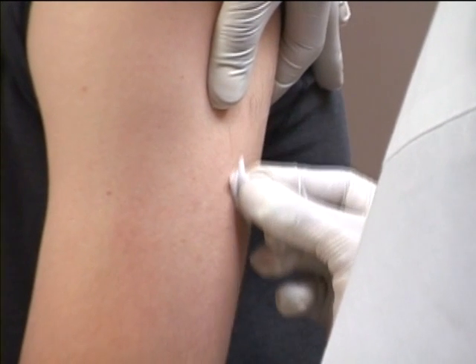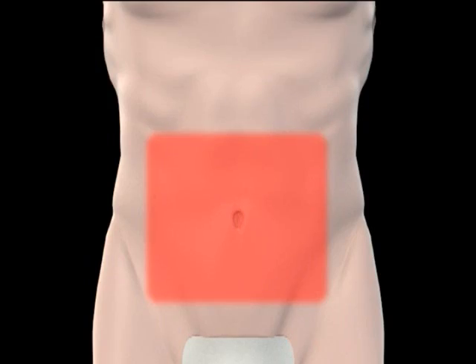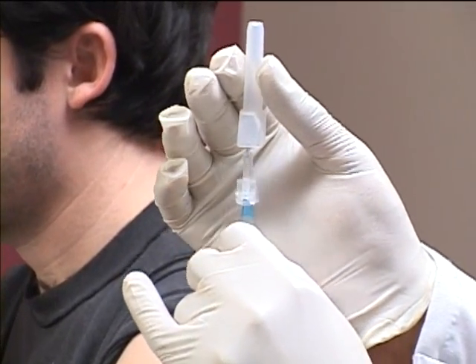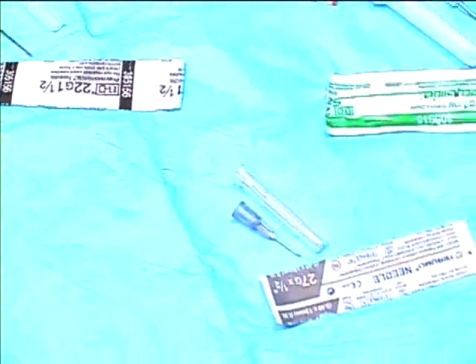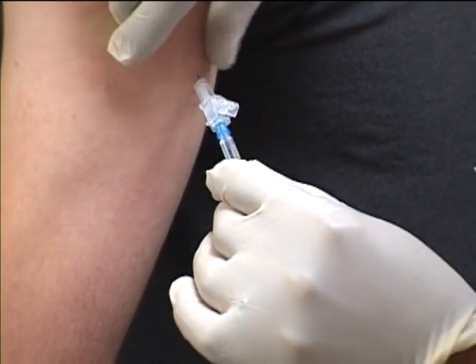Subcutaneous injections are most often given in the fatty portions of the upper posterior arm, abdominal area, and the upper thighs, using a 25 to 26 gauge needle. Needles typically range from 1/2 to 5/8 of an inch in length, and the injections are administered at a 45 to 90 degree angle.